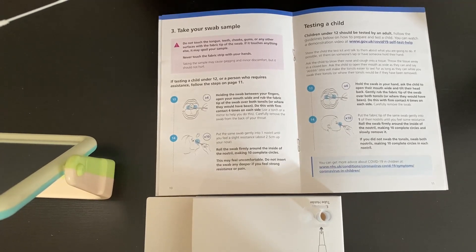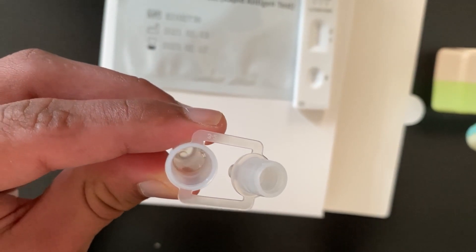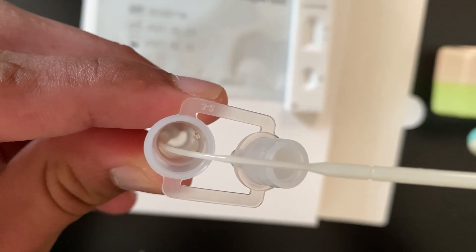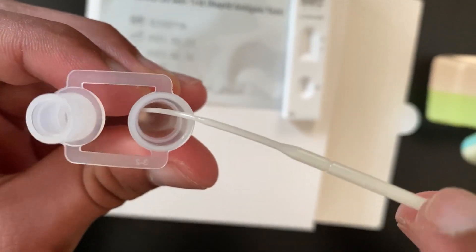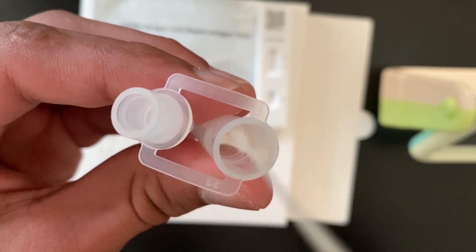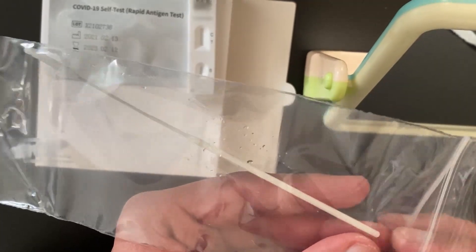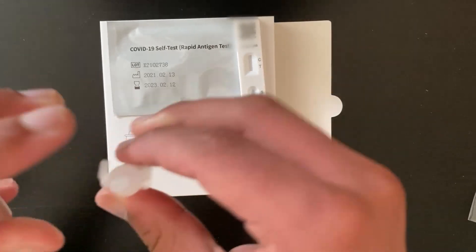It will feel unpleasant, however it only takes a very short period of time. Now you need to put the swab in the buffer solution, bend it and then twist it so that all the fluids from your mouth transfer into the solution. Keep on twisting the extraction tube as you do this. When you're lifting it out, pat it on the sides to ensure that all the fluid remains in the tube. Now you can put the swab in the waste plastic bag, then close the extraction tube and shake it lightly.